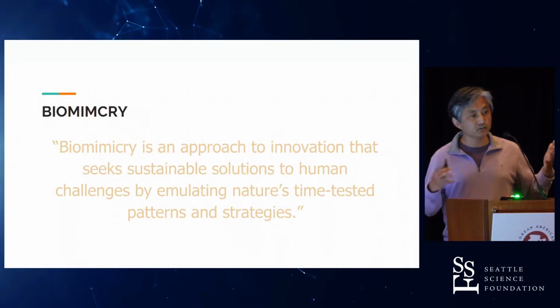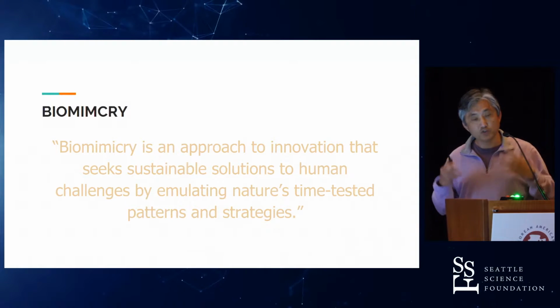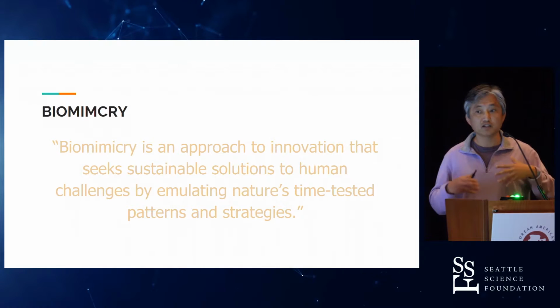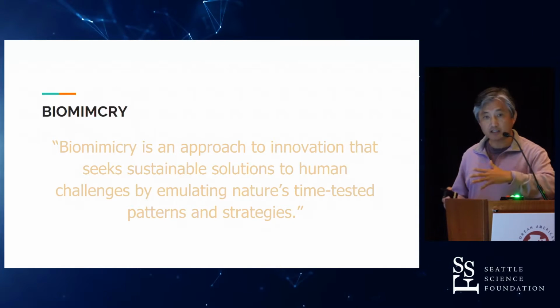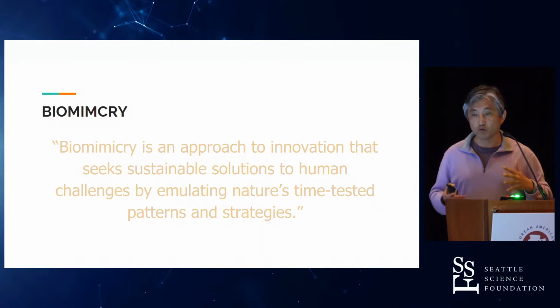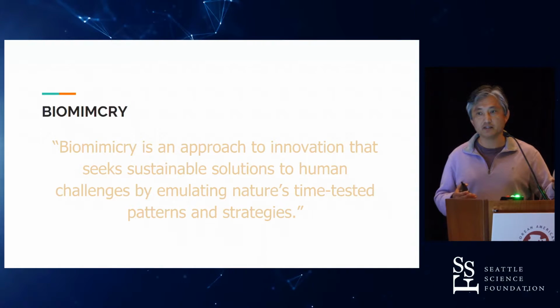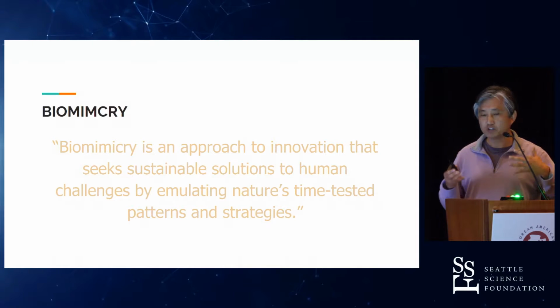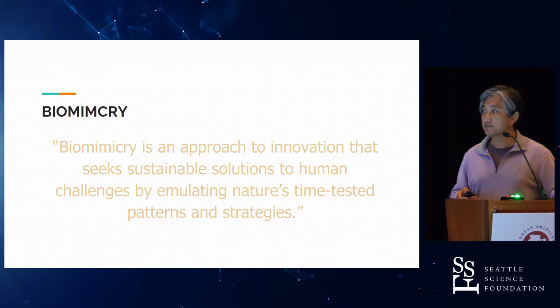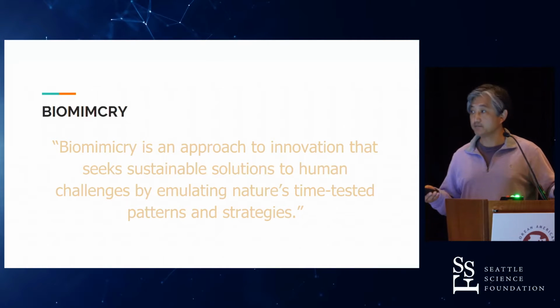So the idea of surface technology is essentially biomimicry, right? We want to create fusion by seeing what the body does in terms of how it fuses itself. We've got to create a surface, where the endplate contacts our graft, so that something takes place that's very similar to what nature does and bone forms. And again, plastic is not what we have in our body. It's a foreign object. And so is it really going to fuse to that plastic that we stick in there when we put PEEK cages into our interspaces, right? So biomimicry is an approach to emulate nature, right?